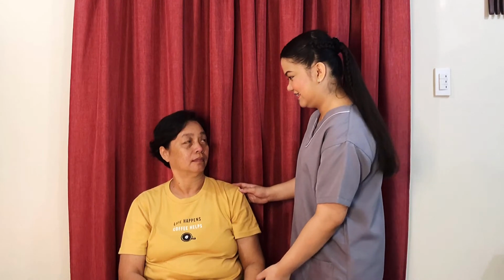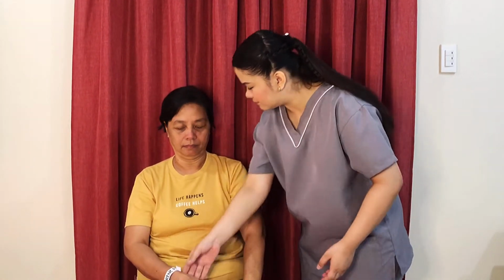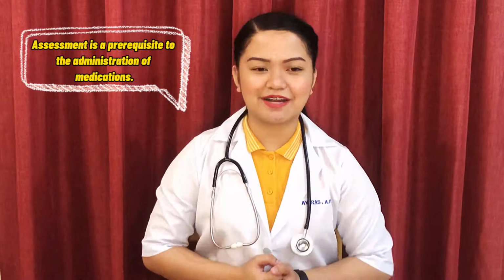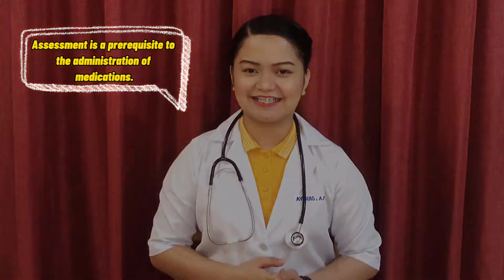And then, assess your patient for any contraindications for the medication. Assessment is a prerequisite to the administration of medications.